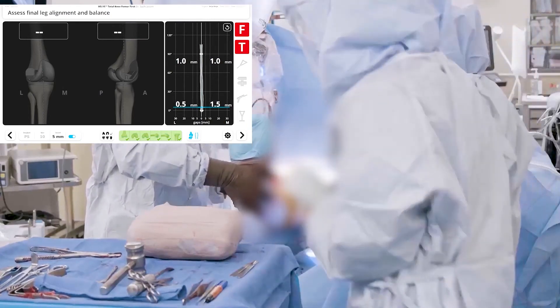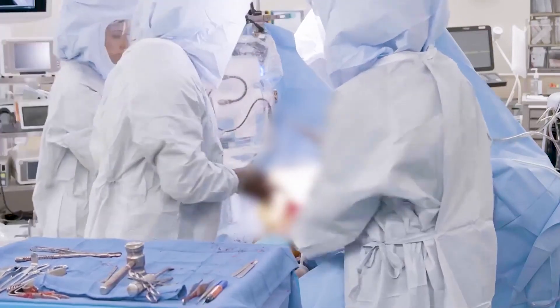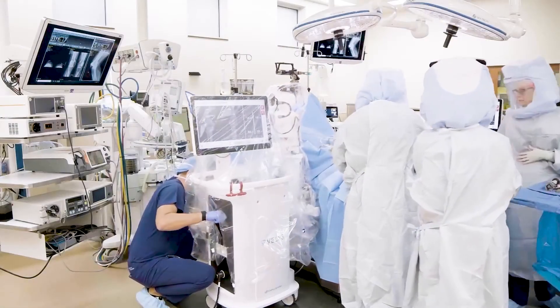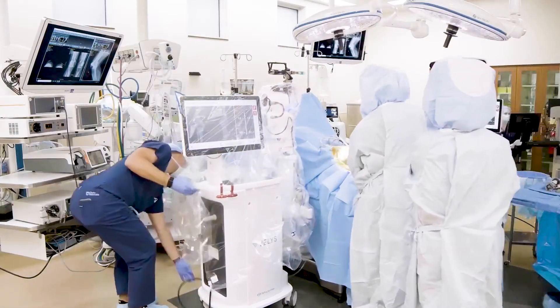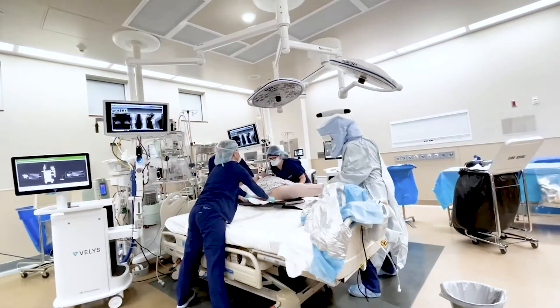Once the bony resections are completed, your surgeon will place the final implants. The robotic system will then be removed from the sterile field and your surgeon will close the incision in layered fashion and place sterile dressings.